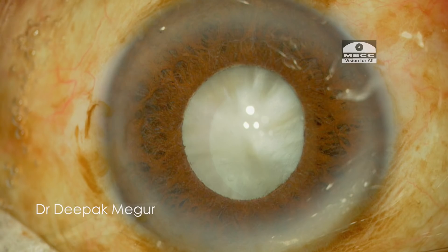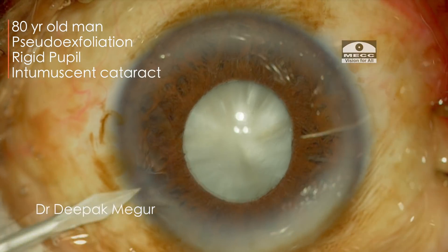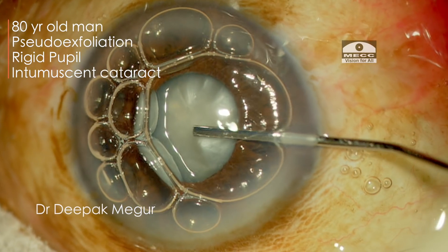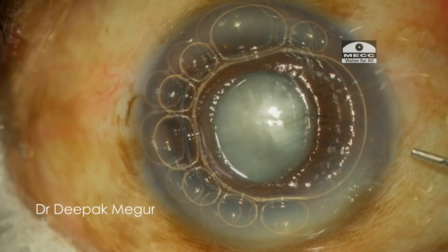This is a case of an elderly male who has got an intumescent cataract along with shallow anterior chamber, pseudoexfoliation, and a rigid pupil. A couple of challenges to deal with in this patient: a tense capsule, small pupil, and a possibility of zonular weakness.